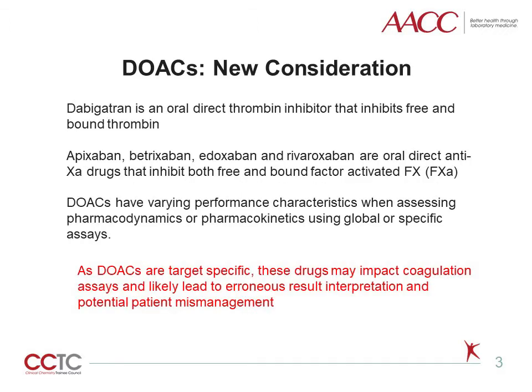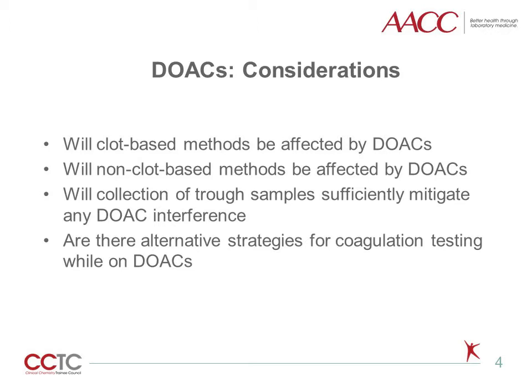In the previous sessions, we provided an overview of DOACs, which include dabigatran, a direct thrombin inhibitor, and the direct anti-Xa DOACs, which include apixaban, betrixaban, edoxaban, and rivaroxaban. We previously described their performance characteristics, including pharmacodynamics and pharmacokinetics, using screening or specific coagulation assays. The new consideration, as DOACs target specific activated factors, the impact of these drugs on other coagulation assays are likely leading to potential erroneous interpretation and mismanagement. As we previously demonstrated, DOACs may affect clot-based assays such as the PT and APTT, but will these observations translate to other clot-based coagulation assays?